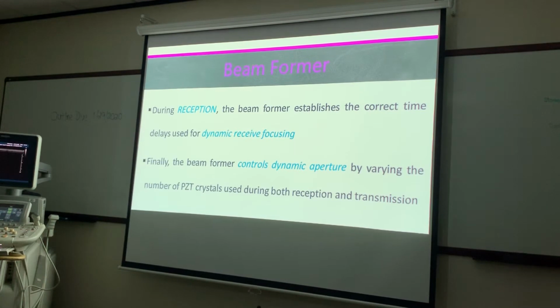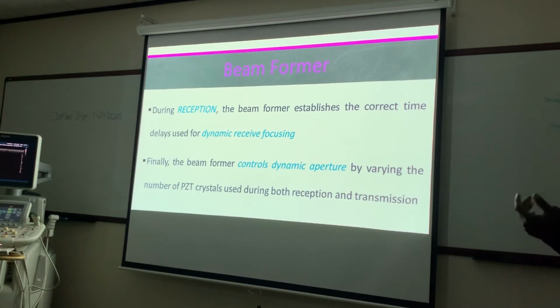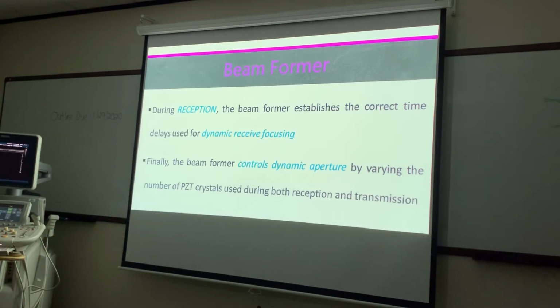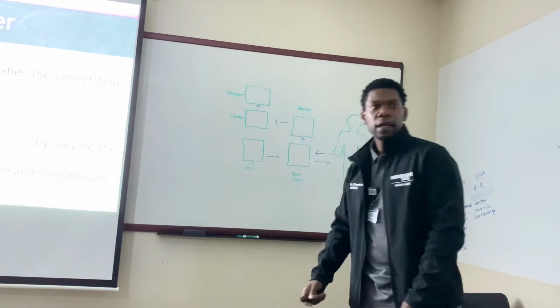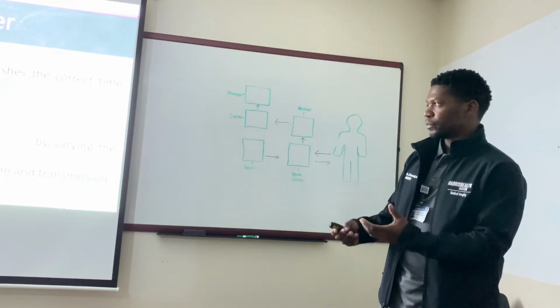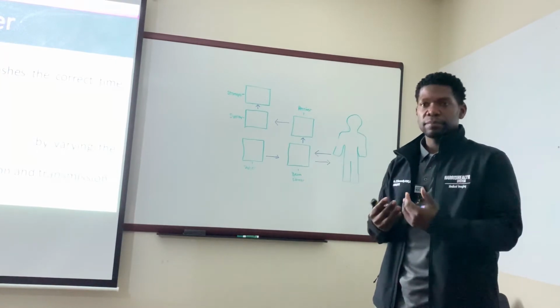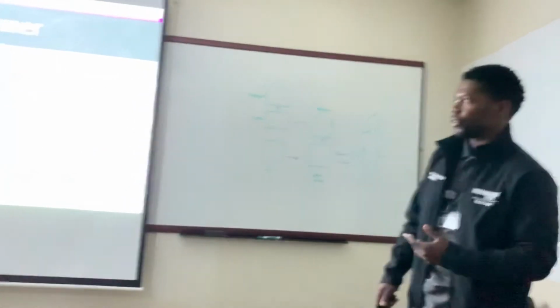So, still during reception, the beamformer will establish the correct time delays for dynamic receive focusing. Because we know after the sound reflects off the patient and comes back, it's going to come back to the beamformer, like I have right here. The beamformer is going to control the times in which those signals get amplified.